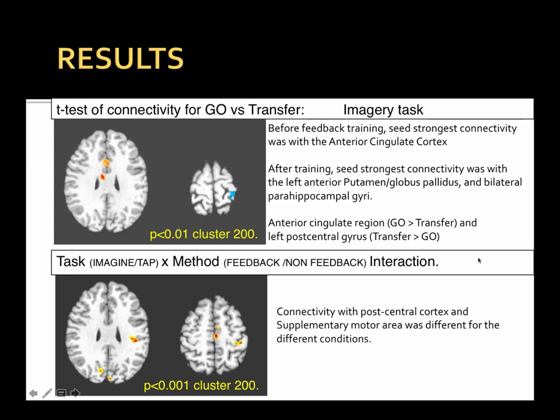So one of the things that come out of this, and there is a follow-up with a group in Switzerland, that collected the data from a lot of studies that did neurofeedback, and then looked at what is the effect of neurofeedback per se, right? Because why would the anterior insula be involved here?